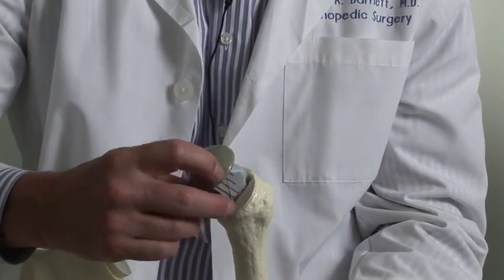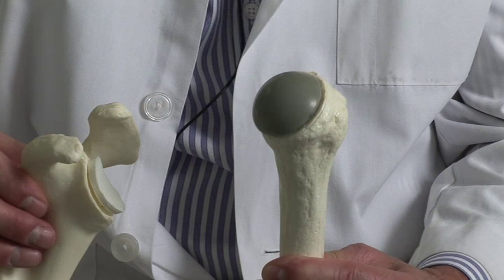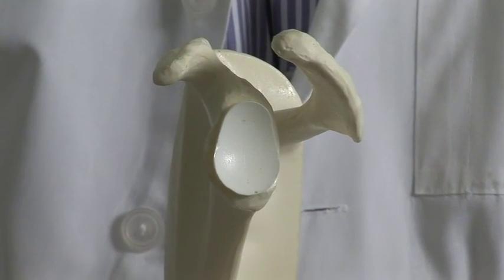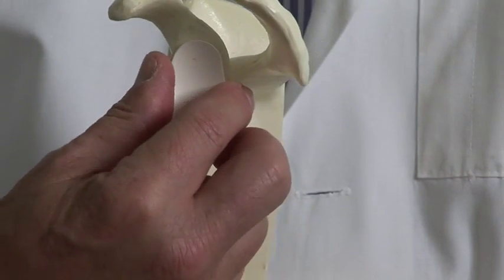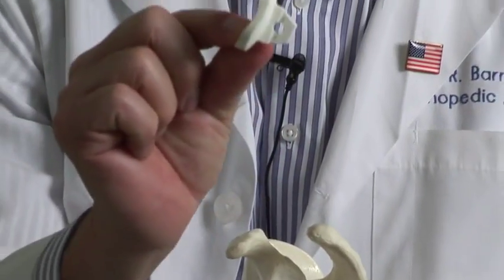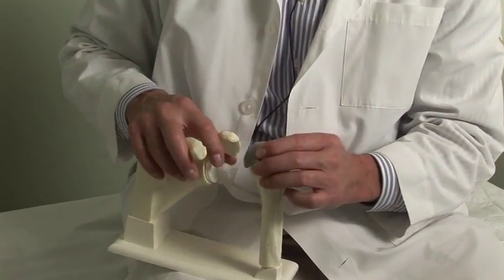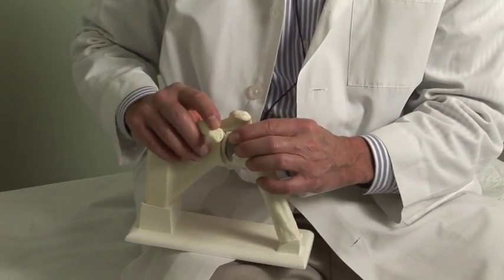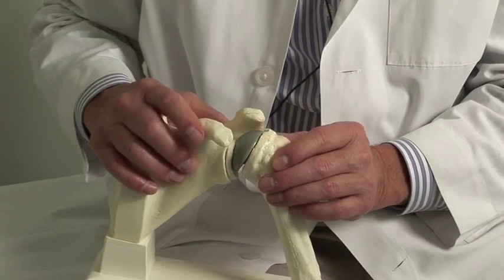rounded structure here can be shaped to your anatomy, and this basically replaces the surface that is worn out, which is the ball side. And this structure over here, which is the shoulder blade, this is the socket, which we smooth down, and then we insert this plastic piece here into the socket, creating that articulation. The socket side is plastic, the ball is metal. This creates a new articulation, which will significantly improve your function and significantly reduce your pain.